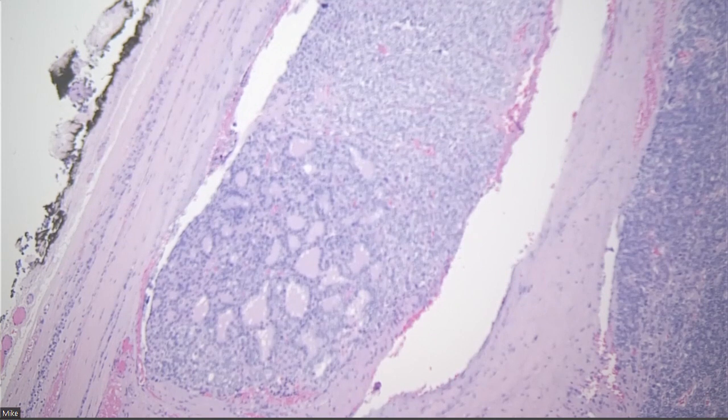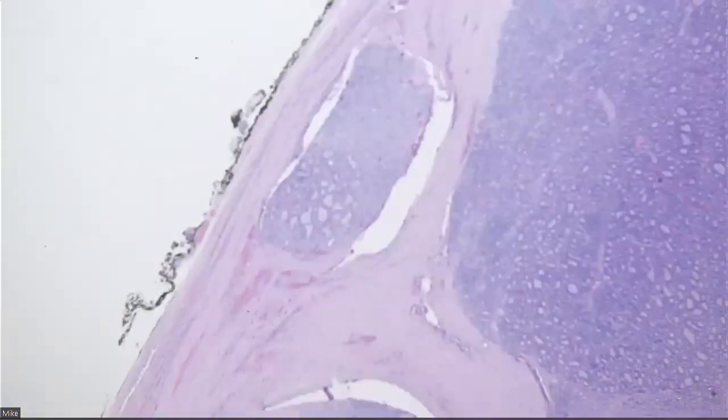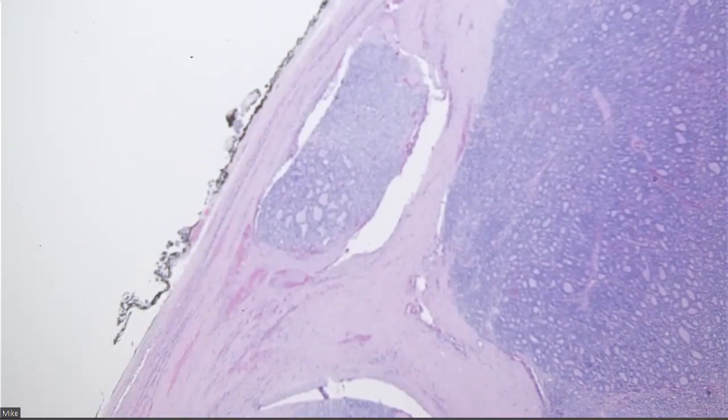Okay, so this person has a lot now going against her because she's got angio invasion and she's now got some arguably solid growth. So then we can at least make a diagnosis of cancer because of the angio invasion. Number one, what type of cancer would you favor in this patient? Follicular, okay. And then once you've made a diagnosis of cancer, you have to ask yourself, can it be worse? What makes it worse? What are the criteria for making it worse than just follicular?